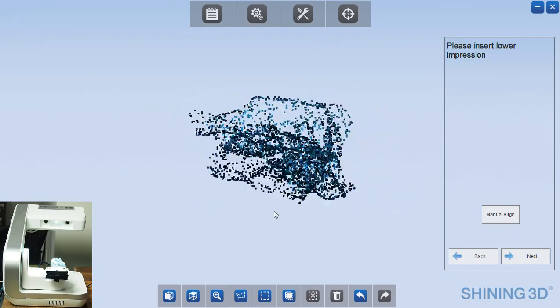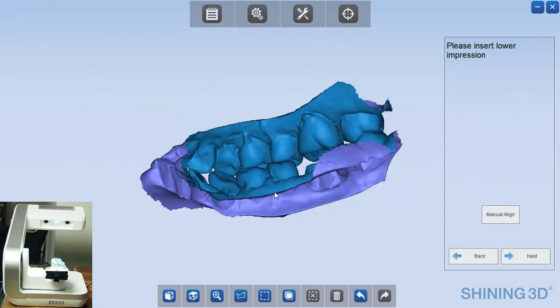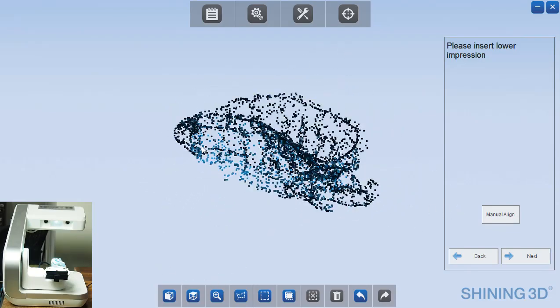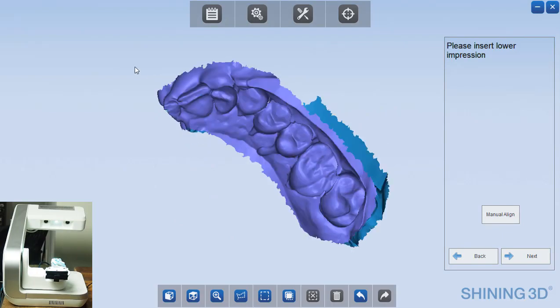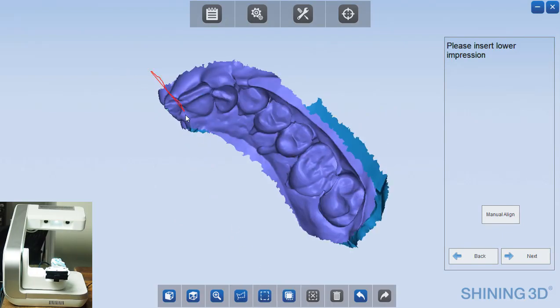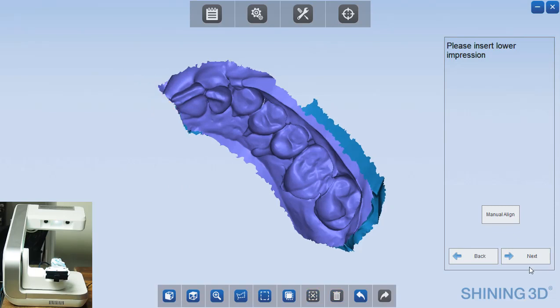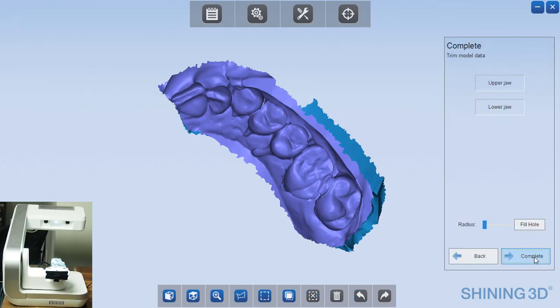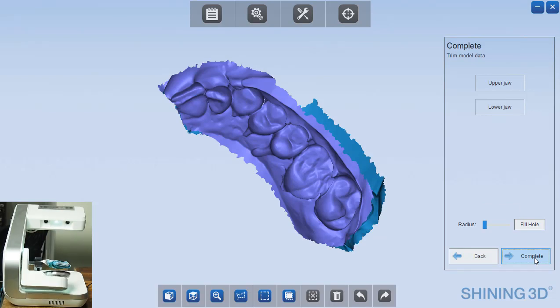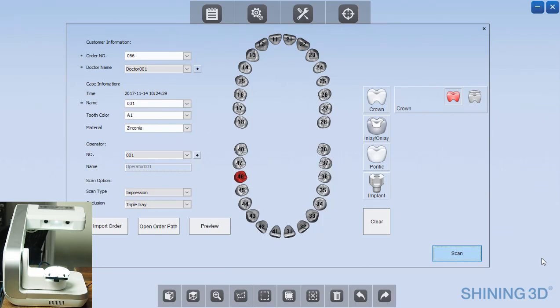And at that point, if you wanted to view these STLs, you could click open order path on the home screen and it will open up the folder where those are saved. They will be labeled as upper and lower. These could now be sent to your lab for design or they could be opened in whatever design software you may have, Three Shape, exocad. But at that point it's really done. And so that completes the process.